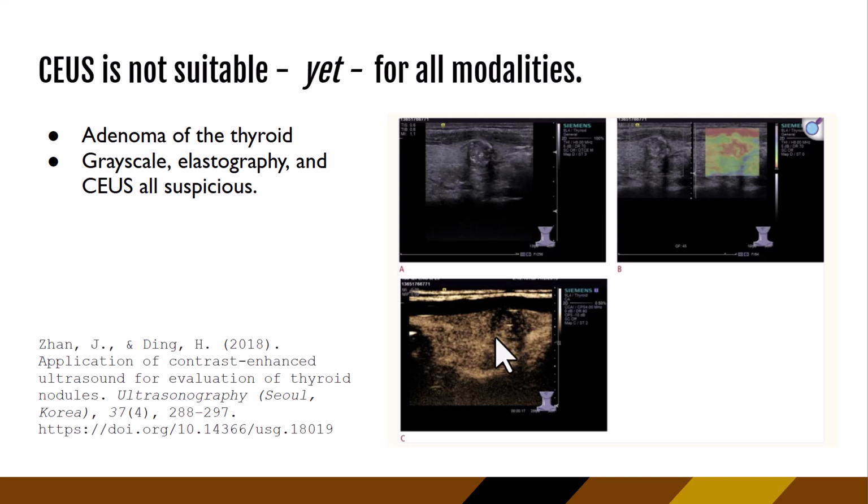And so if we go by what we talked about with the kidneys and the liver, then again, this is a little bit more concerning for a malignancy. But after biopsy, they ended up finding out it was a benign adenoma. So despite everything that we are seeing, again, ultrasound isn't perfect. It's just a reminder that more studies need to be done, and there definitely are being conducted all over the world.